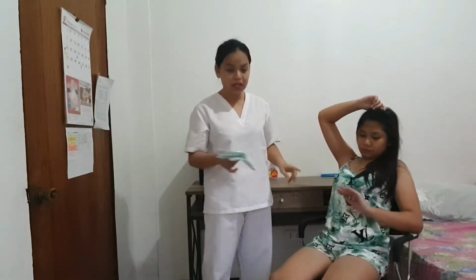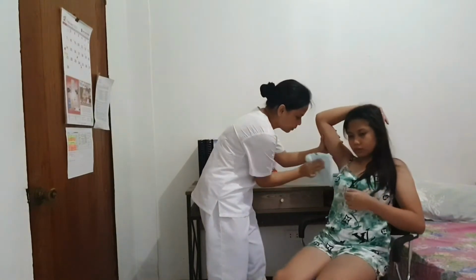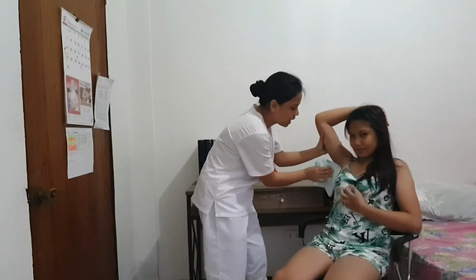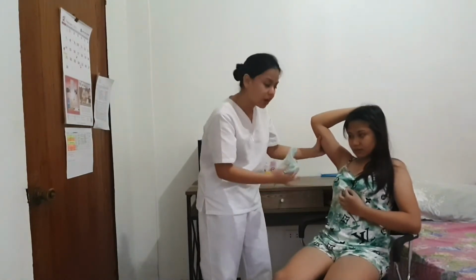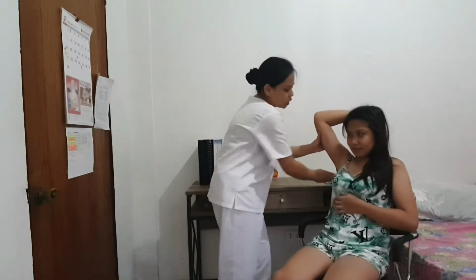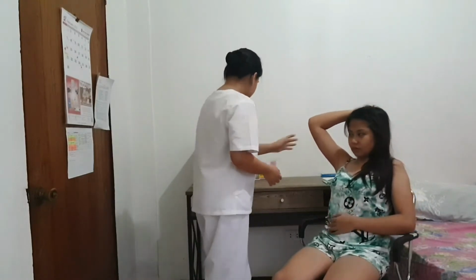Okay, so I have to wipe it off, but please remember that in wiping off the patient's perspiration, you just have to tap it like this. It should be gentle. Because if you rub it, it will cause friction, and then the friction will cause heat. Therefore, it will increase her temperature. Okay, so I have finally wiped it off. So my patient is ready for the axillary method.